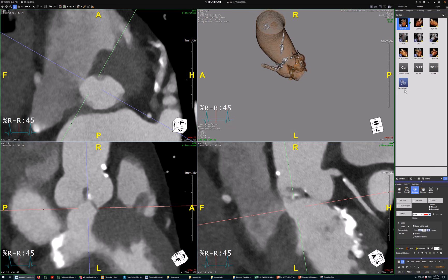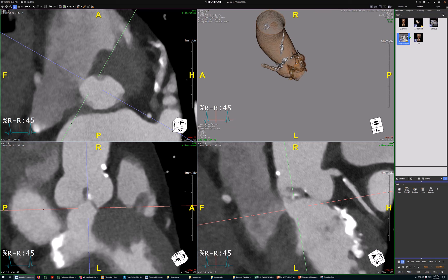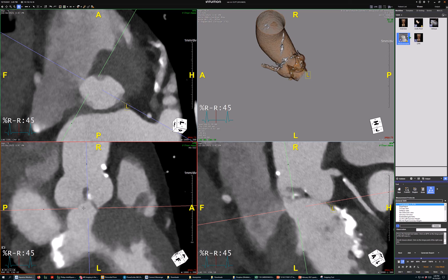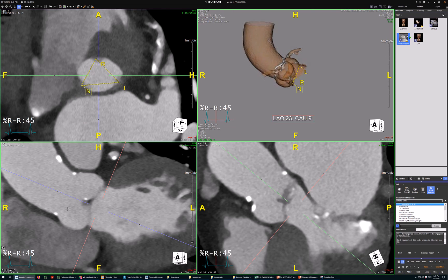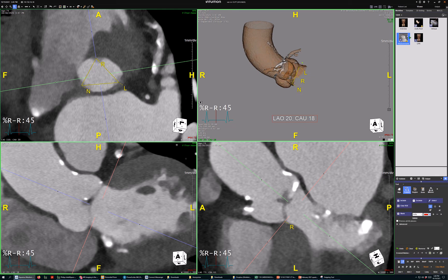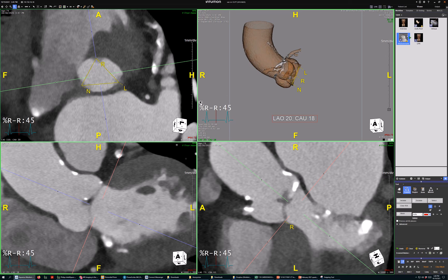Come here to workflow, from cardiac down to TAVR, then click measurement and then the landmarks triangle, and we'll go from here. This is the left — click, little L comes up. This is the right — that's the next one. And then this one over here is the non. We get a little triangle, and we can click three-cusp view. That's our first view for the aortic root. Trim this to make it look a little more presentable and take a picture. C for a picture, or hit this little camera. That's our first picture.